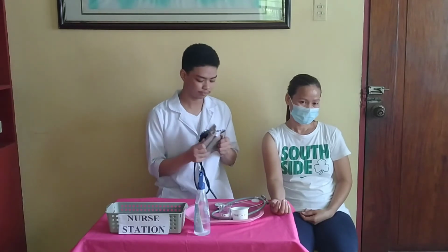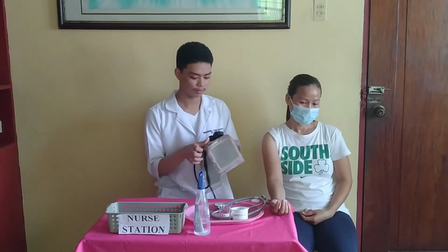Next step, wrap the deflated cuff evenly around the upper arm. Then locate the brachial artery of the client. Then, the border of the cuff should be 2.5 cm or 1 inch or 2 fingers above the antecubital space of the client. Ilalagay ko lang po.